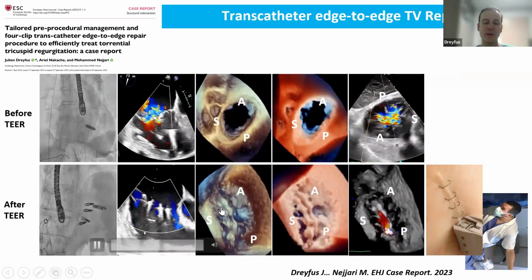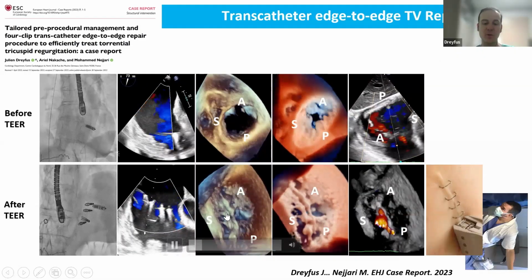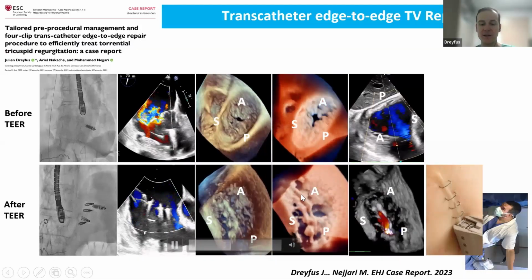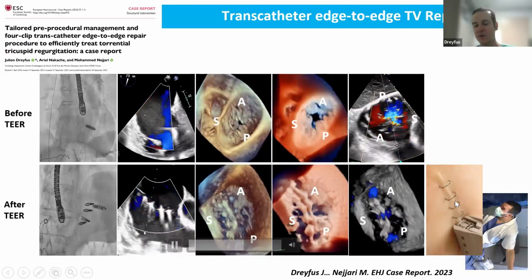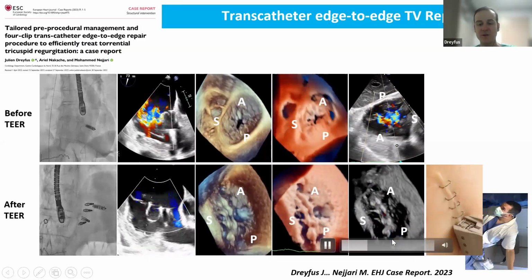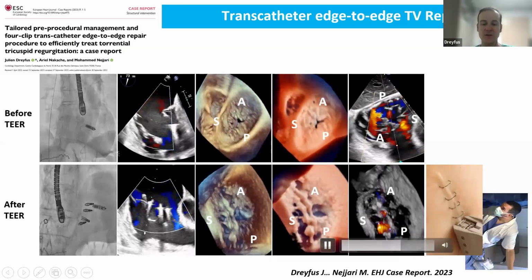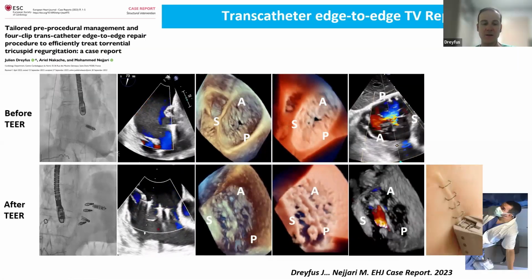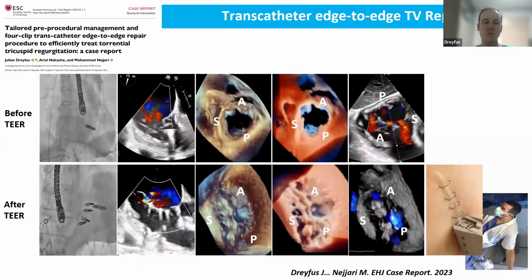And then we performed a zipping of the valve with 4 clips, 2 anteroseptal, 2 posteroseptal, and you can see that they are perfectly attached, just like a surgical stitch. And at the end, you can be sure that the result is perfect. And 2 years later, the patient has not been hospitalized since the intervention and is feeling much better.